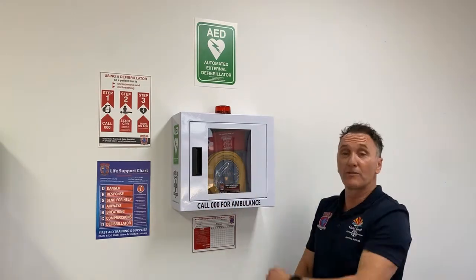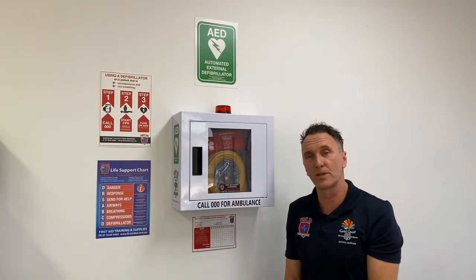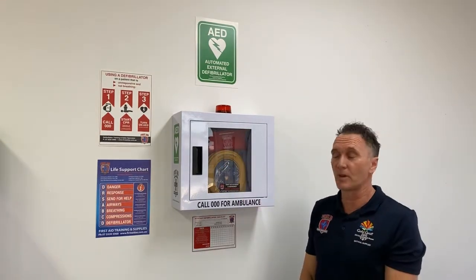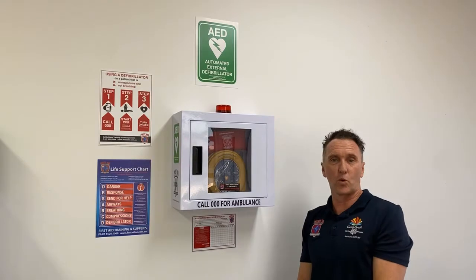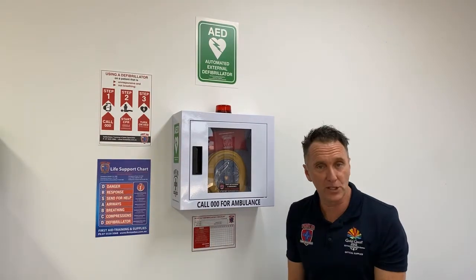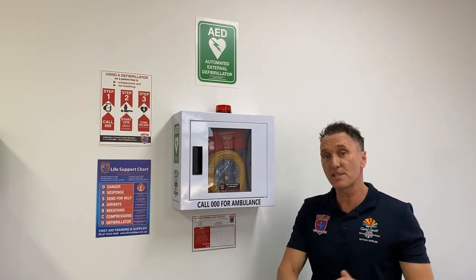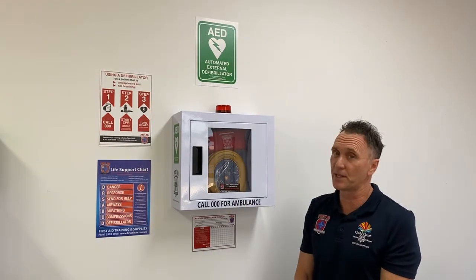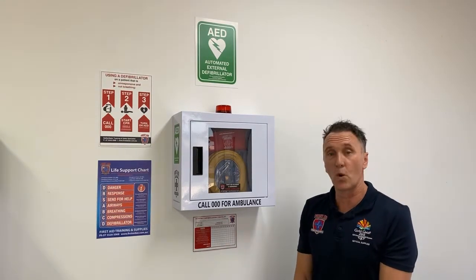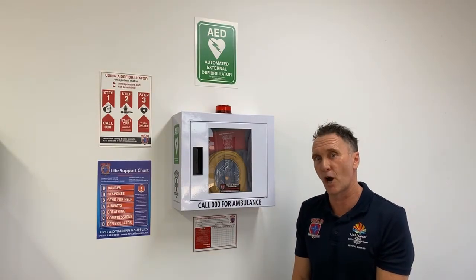As you can see, we've got all the signage required to make this defibrillator visible within the workplace: the green AED sign, the how-to-use-a-defibrillator chart, and the DRSABCD wall chart for your first responders. We also have the monthly checklist, which enables you to keep your defibrillator compliant as per the First Aid Code of Practice within your state, ensuring you're checking your defibrillator regularly to make sure the pads and battery haven't expired and the indicator is ready to go.